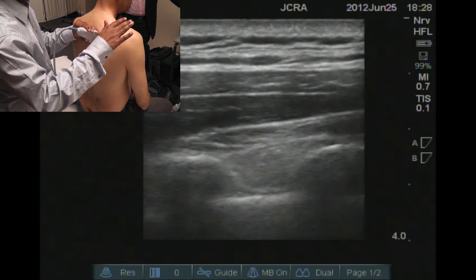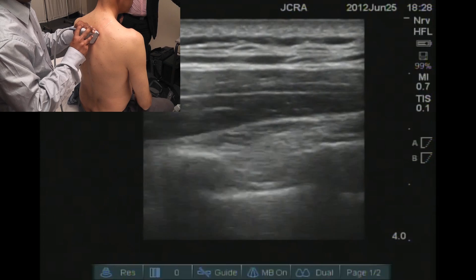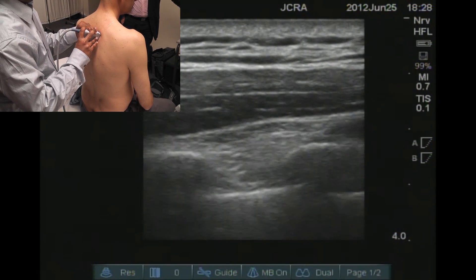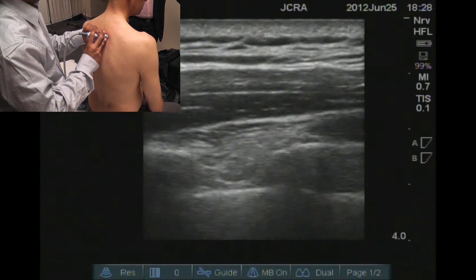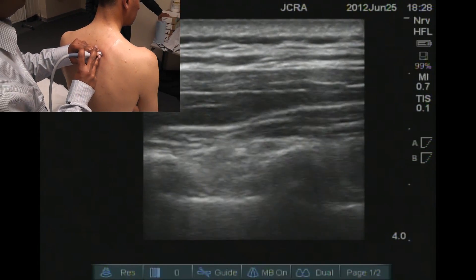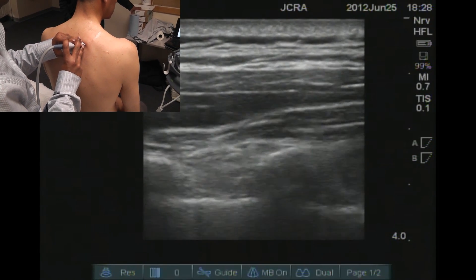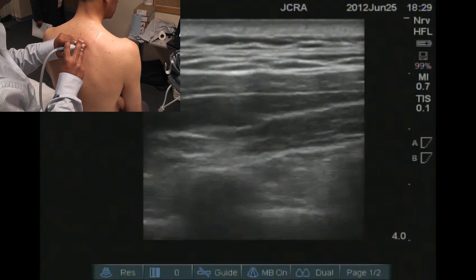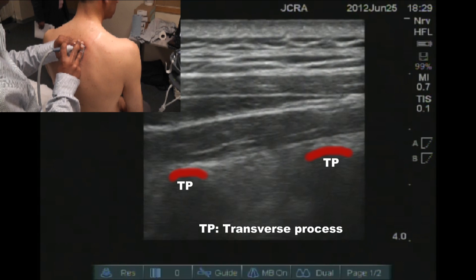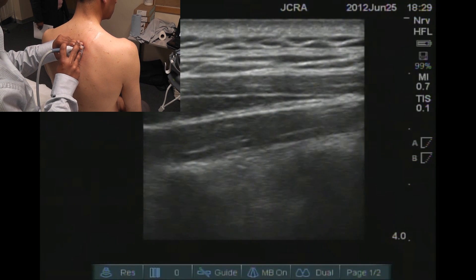The parietal pleura is quite obviously seen as shown on that image. If you go closer to the transverse process on the midline, the shape of the rib changes from being a semi-spherical thing to somewhat like a hump. At that point the image quality deteriorates, so you go back to the same position where you have a better quality of image.